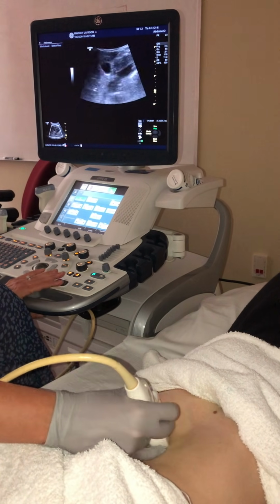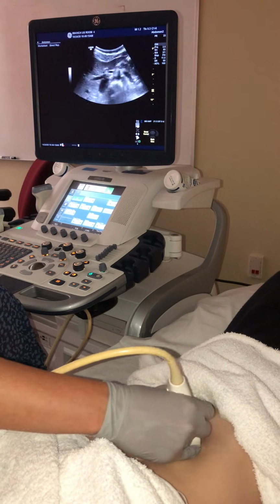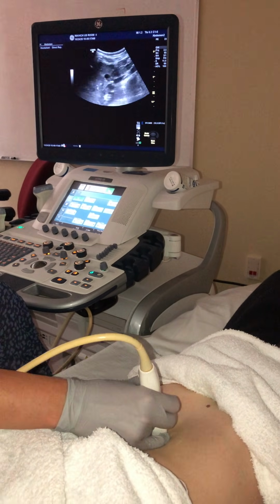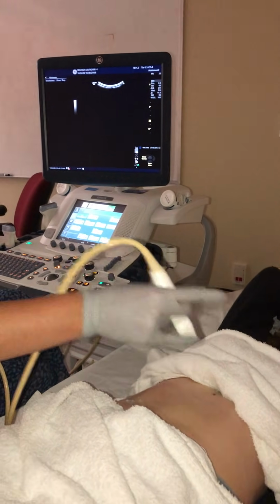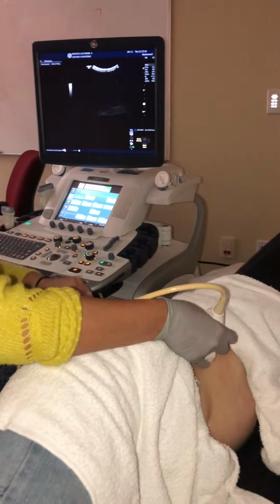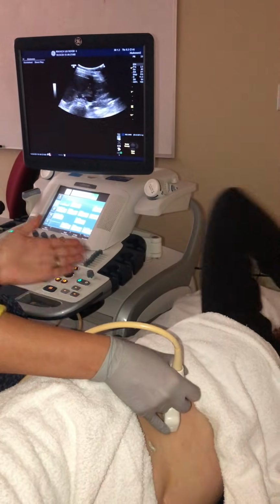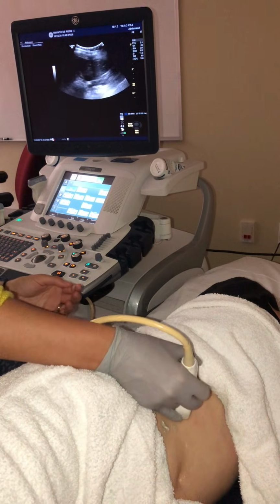And then also when we're doing our gallbladder, we like to turn our patient on their side. So we're gonna have our patient turn into a left lateral decubitus. So Meg, you're gonna turn up onto your left side. Okay. Perfect, she's on a slight angle. She's not fully up on her left side. She's on about a 45-degree angle.